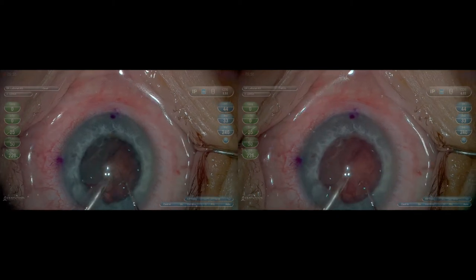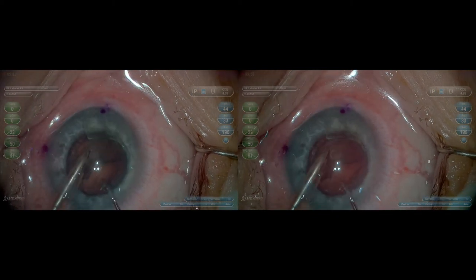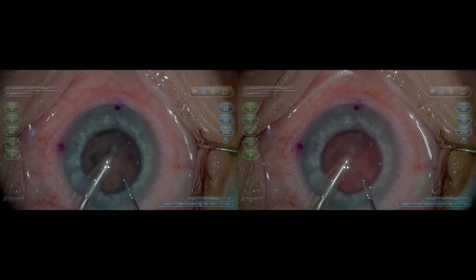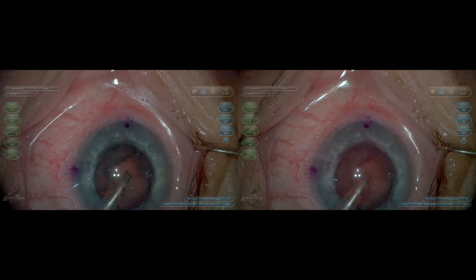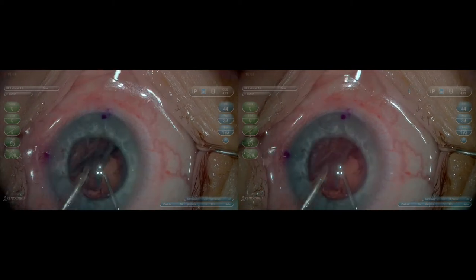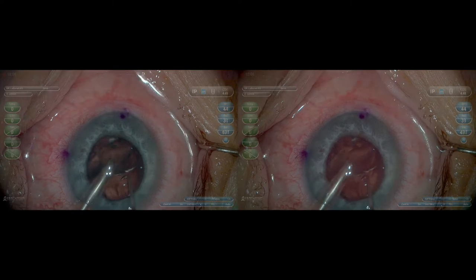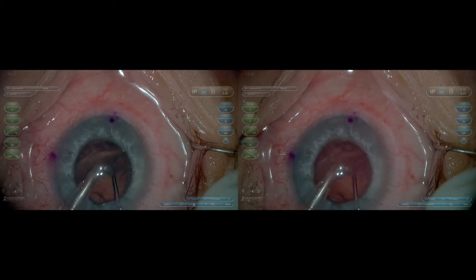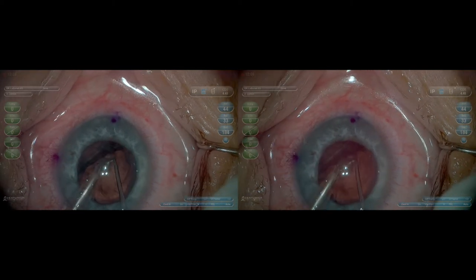As half the lens is removed, you can start to see more clearly the posterior capsule and red reflex, and how the software starts to adjust the lighting to optimize the image with Ingenuity.